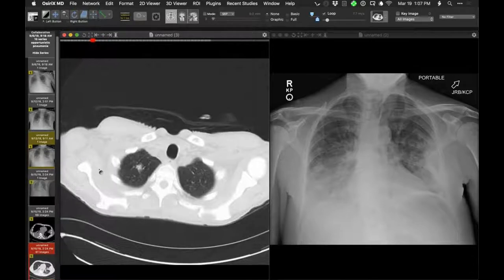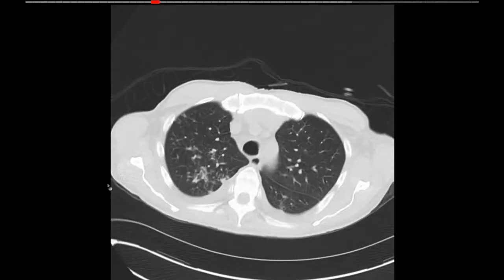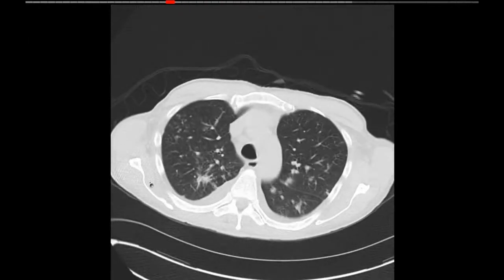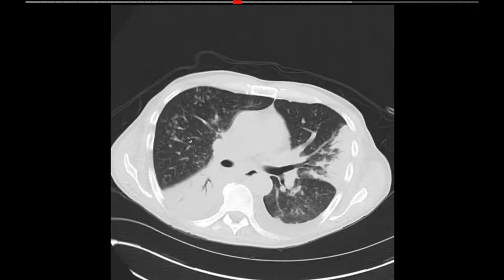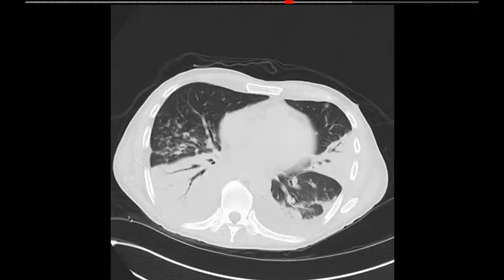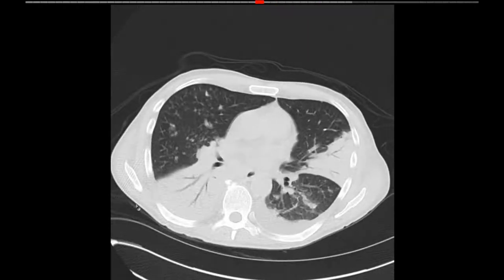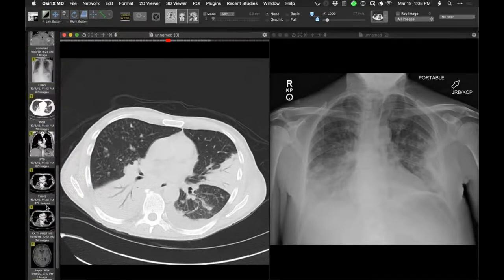And it shows nodules. There's a circumscribed nodule there. Some smaller nodules in the upper lung zones. Some of these opacities here are undoubtedly intraluminal material within lumens of small airways and bronchioles. And then we have, and the same thing up here, airway abnormality. Then we have much more extensive consolidative opacities in the lungs mostly in the right lower lobe. So sort of multiple patterns of abnormality are present.